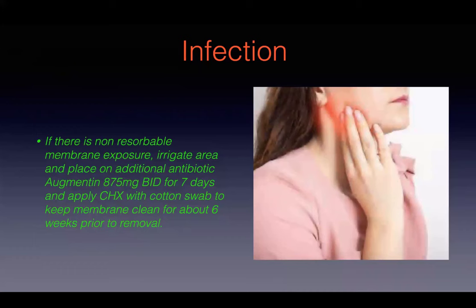So I let her know we would have to stage this, have to do GBR, and then go back in about 5 to 6 months and see where we're at. I never overpromise the patient. I always let them know there's always a chance that we may need to do additional bone augmentation.